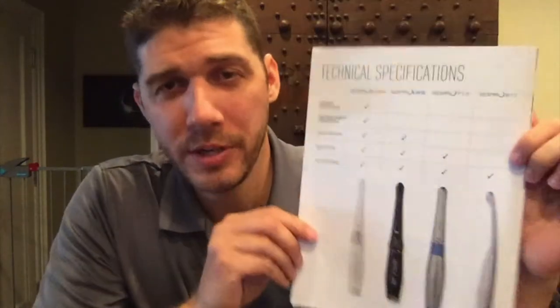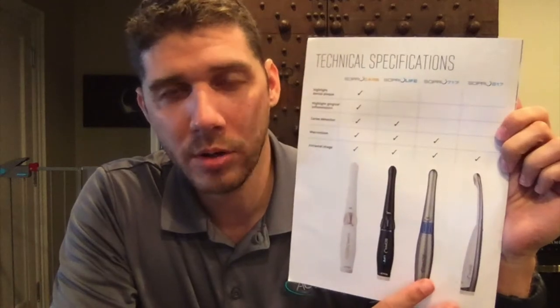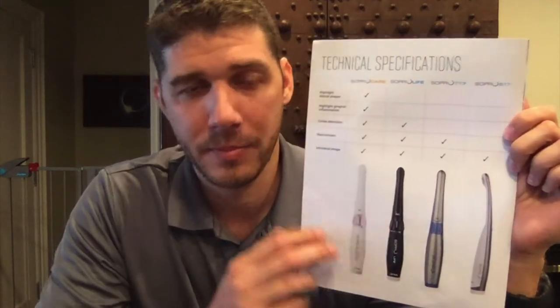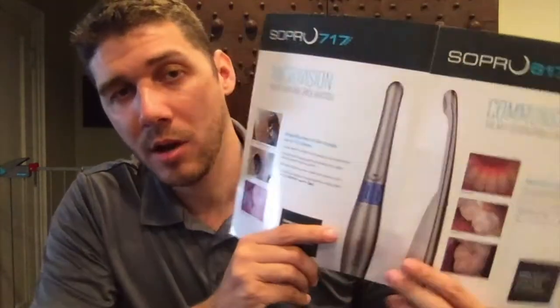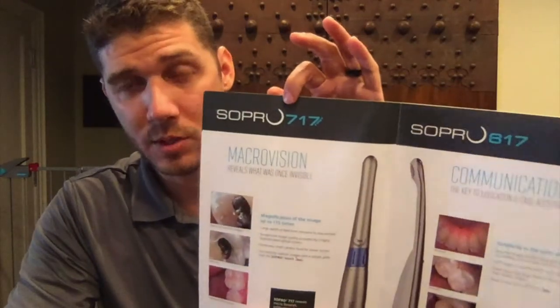Here at Action, we have four different cameras — two intraoral cameras and two diagnostic cameras. Our intraoral cameras consist of the SOPRO 617 and the SOPRO 717.